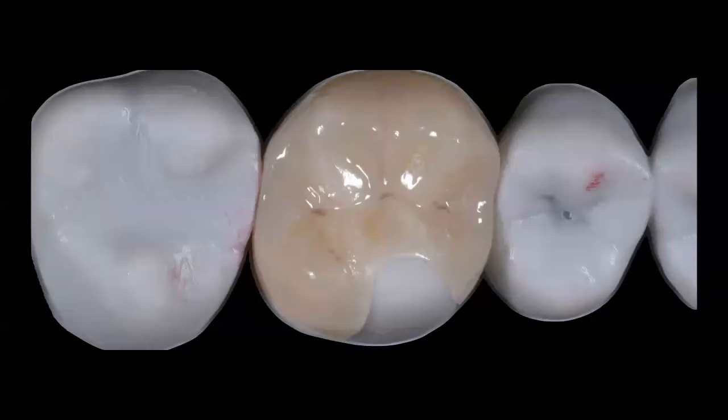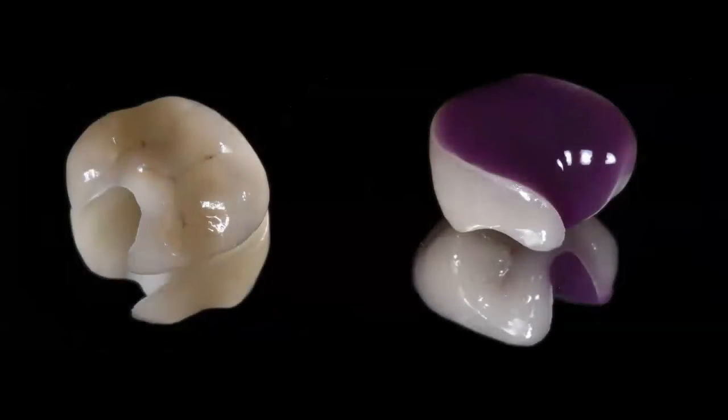So because you've already received your restoration etched from the lab, my recommendation would be, first, go ahead and clean the restoration with the phosphoric acid. You are normally going to see that restoration with that white precipitate salt on the intaglio surface. So just go ahead and use your phosphoric acid for 1 minute. That is exactly what I'm doing right here. After that 1 minute phosphoric acid etch, just to clean the intaglio surface or free it from that precipitated salt, go ahead and move forward with your ultrasound.